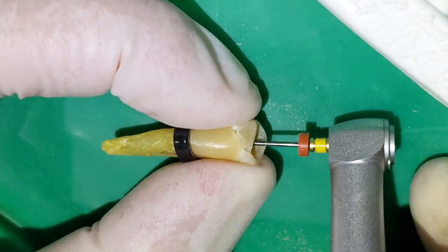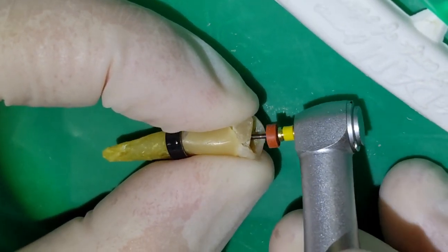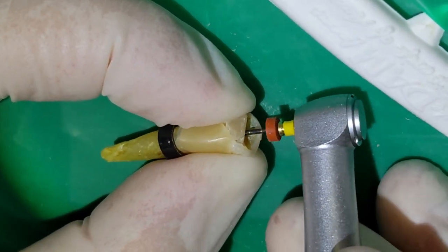I always joke with my patients and tell them whenever they come in for a root canal, it's actually pretty boring. I'm doing a lot of stuff, but you're just sitting there with your mouth open and the rubber dam on your tooth.